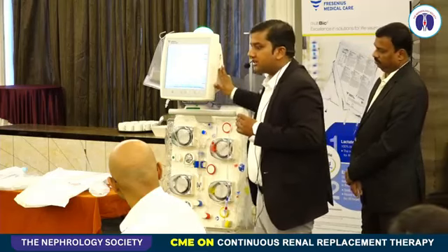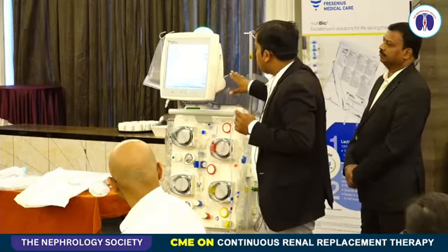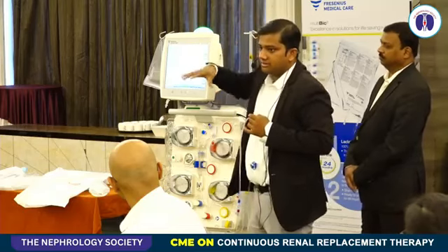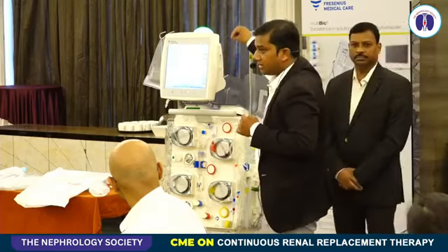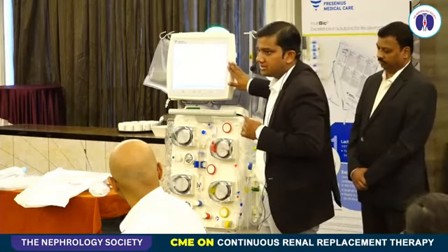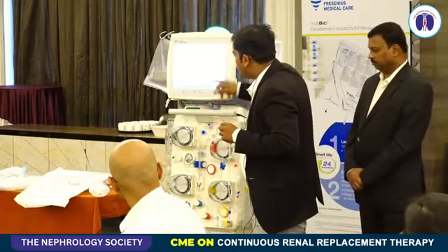So it is always advisable, once we are running this machine, that it has to be away from the AC duct, and a direct ceiling fan should not be there, because some air pressure can even deviate the machine scales. These scales are so sensitive in terms of that.